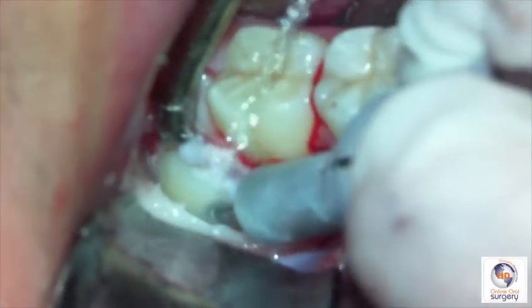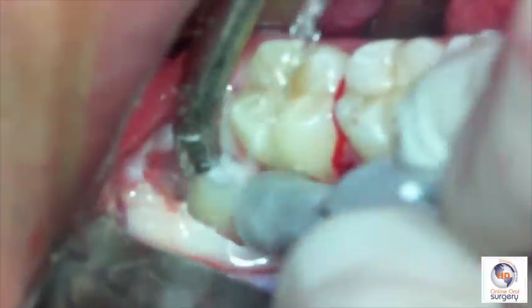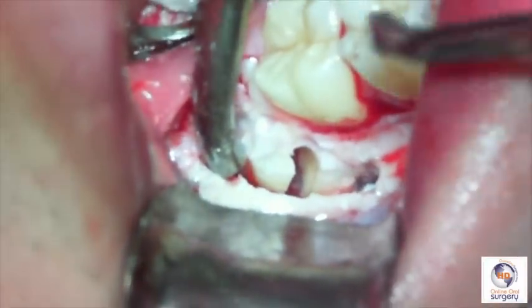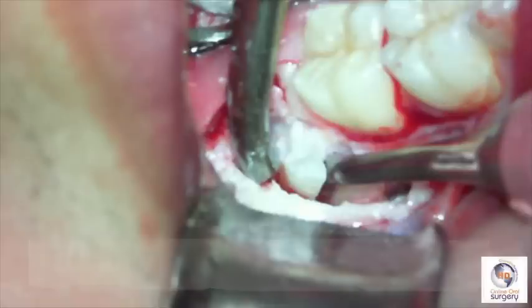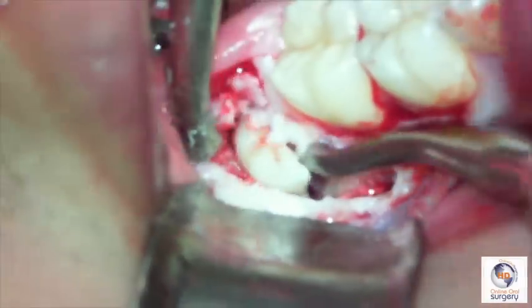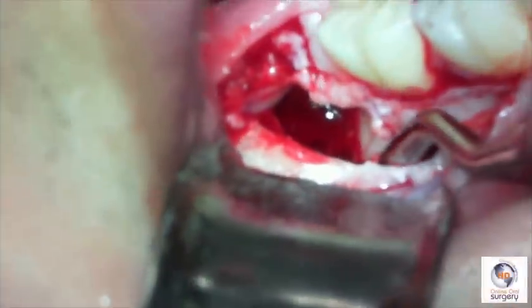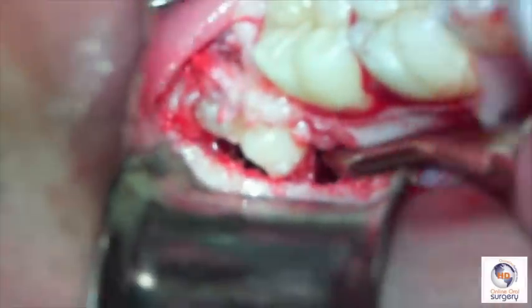Once we've exposed it and located the furcation, we're going to bisect the crown. We only allow our burr to go as deep as two-thirds the width of the crown and the roots — we don't want to go too far lingually, otherwise we risk injuring the lingual plate and possibly the lingual nerve as it's passing by. We're then going to split the tooth using a 46R elevator placed into the furcation. We give it a rotation to split the tooth, rotate the distal half out, and take that out surgically. With the elevator, we take out the distal half of the tooth, then do the same thing with the 46R elevator into the mesial trough, and very easily rotate the mesial half of the tooth crown and roots out of the socket.